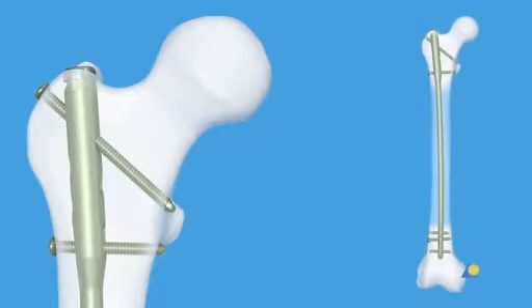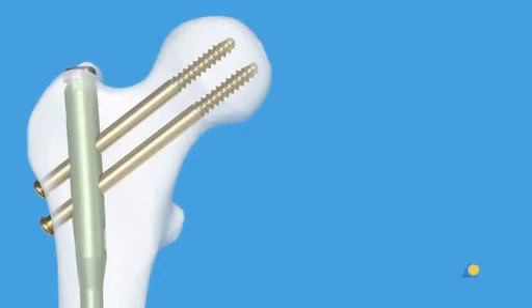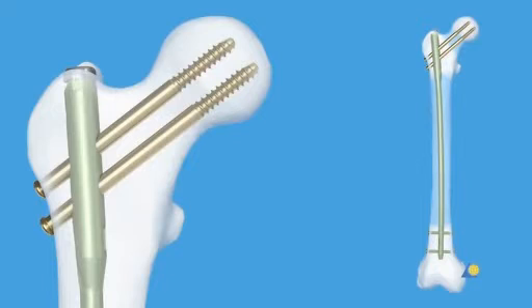Standard locking is used with 3.2 A, B, and C type fractures. Recon locking is used when there is a combination of 3.2 A, B, and C fractures with 3.1 B type fractures, when the fracture site is close to the lesser trochanter, or especially with subtrochanteric fractures. In this practical exercise, recon locking will be demonstrated.